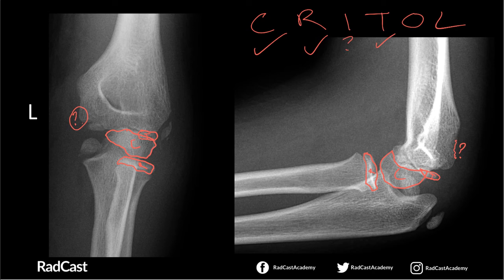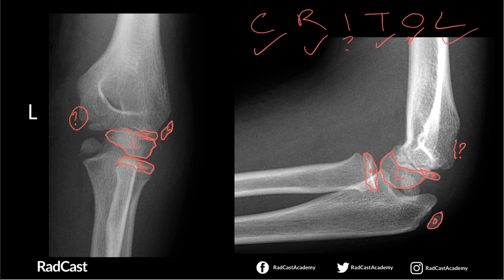We've got the trochlea and we're still missing the medial epicondyle. O for olecranon — it's quite difficult to see on the frontal view, but on the lateral view, there it is in all its glory. We've got the olecranon ossification centre. And finally, he should have a lateral or external epicondyle — and here it is. Often you can't really see it on the lateral view; it's better seen on the frontal. But something doesn't add up — we don't have a medial or internal epicondyle, yet we've got everything else.